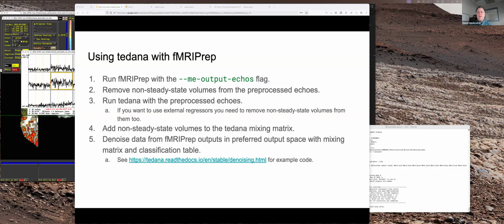It's also occurring to me, I'm not the fMRIPrep user in case you couldn't tell. I think fMRIPrep essentially builds in a version of tedana into each version of fMRIPrep. So it's a bit more static, where in AFNI you can pull the newest version and it'll just run whatever you have, which again is more rope. So it's a little bit easier to be on the cutting edge within the pipeline, but also it's a little bit easier to end up running different versions on different data sets in a study if you're not careful.